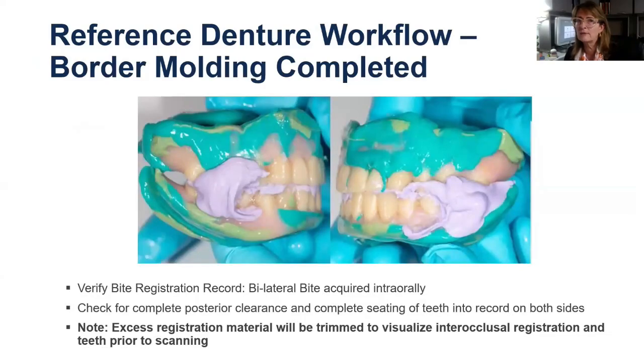And this is an example of it all done together, right? The reason the bite registration is in place is when you sit the patient upright and attempt to take a bite registration of them wearing their dentures, they tend to slide a little bit. So take a little blue mousse or some heavy body impression material and just do a little bit on the occlusal surfaces so that you can place them into proper vertical, let it set, and then take the bite registration.